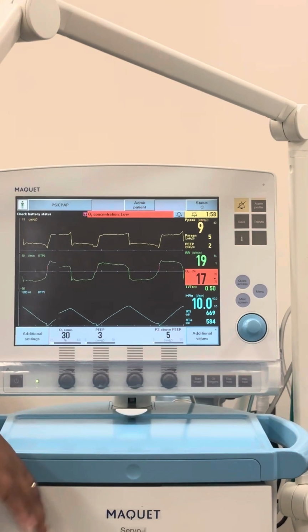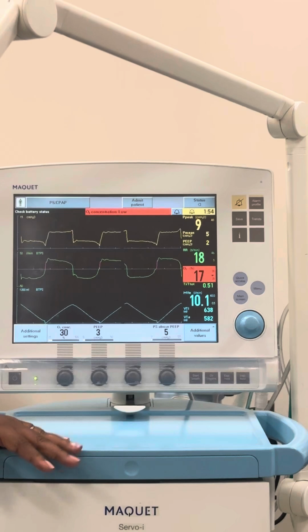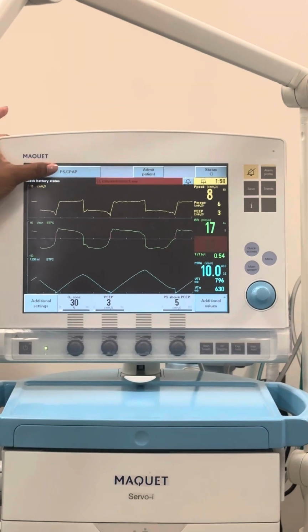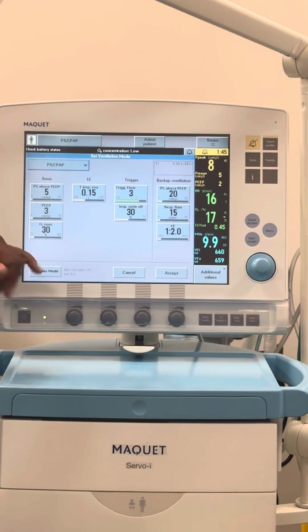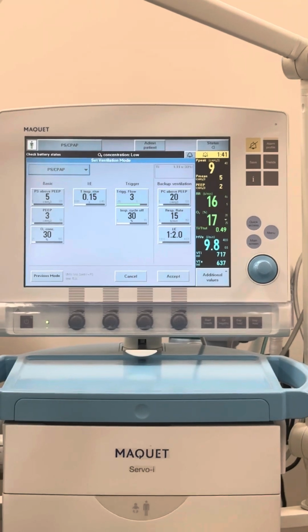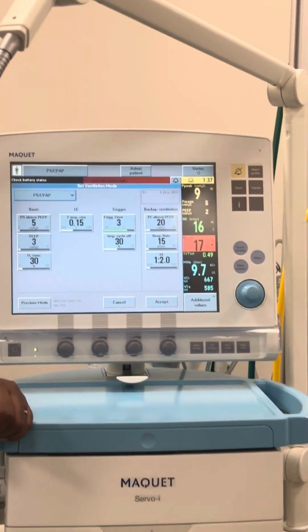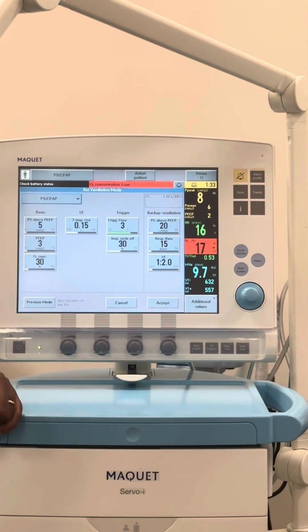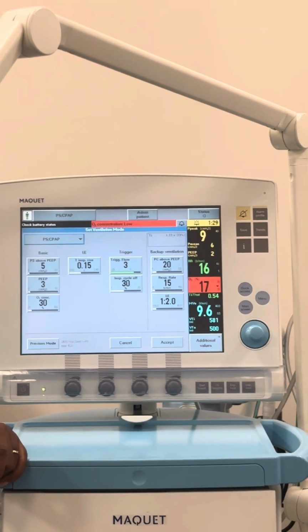So I think you guys are probably familiar with vents enough to know how to do mode changes and what settings to do. So there are some percentages in your settings that you don't have to worry about. So if it's really like a percent or something, like breath cycle percent or inspiratory rise percent, you don't have to worry about adjusting those. You can as you go through different scenarios, but for initial setups, we're not going to have you do that. What y'all got? We good?